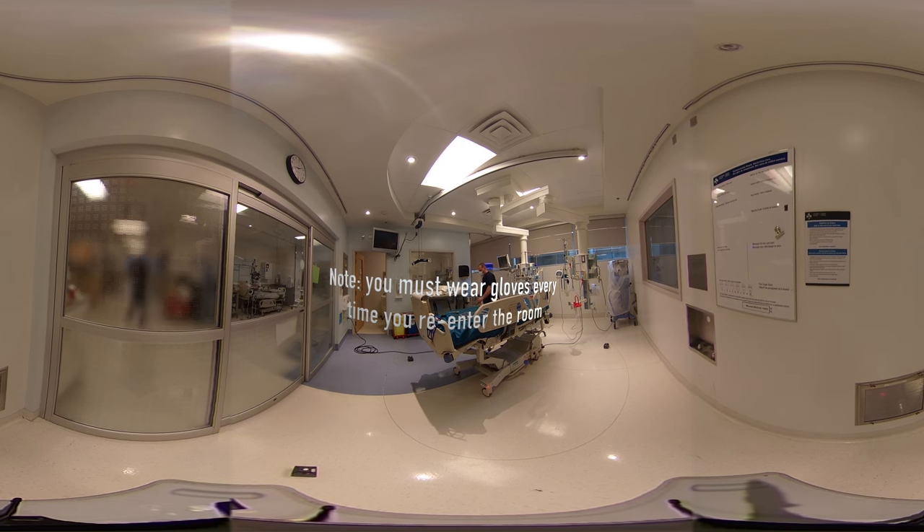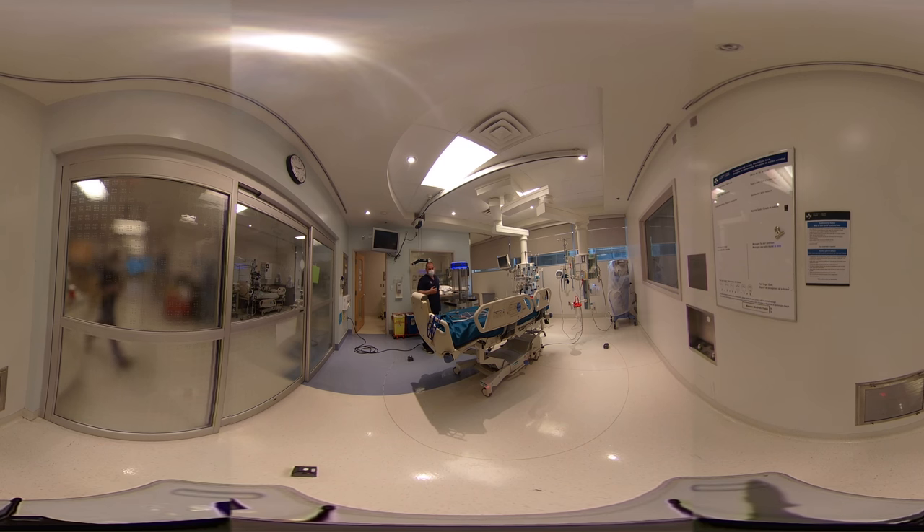Now we're repositioning the ultraviolet disinfector because sensor number one has reached its target ratio. Once that is achieved, you move the machine — not the sensor. It can sometimes be a little more difficult because of the equipment in the room, but try not to hit the sensor and move it, because the machine is already calibrated for where the sensors are positioned.